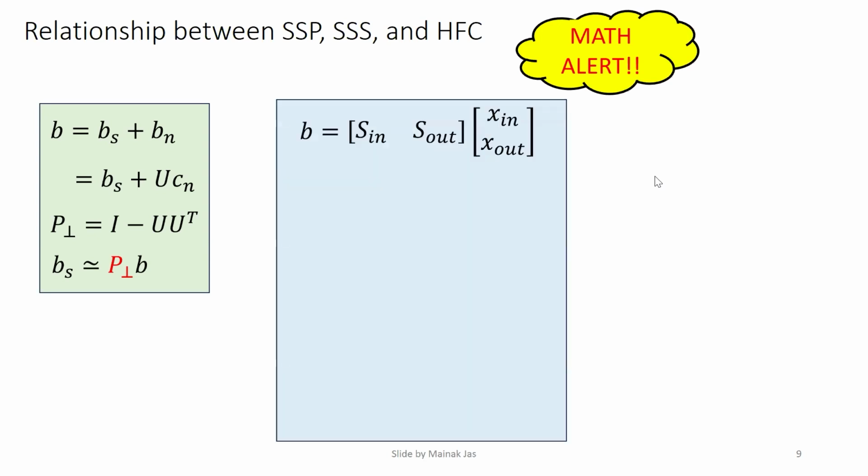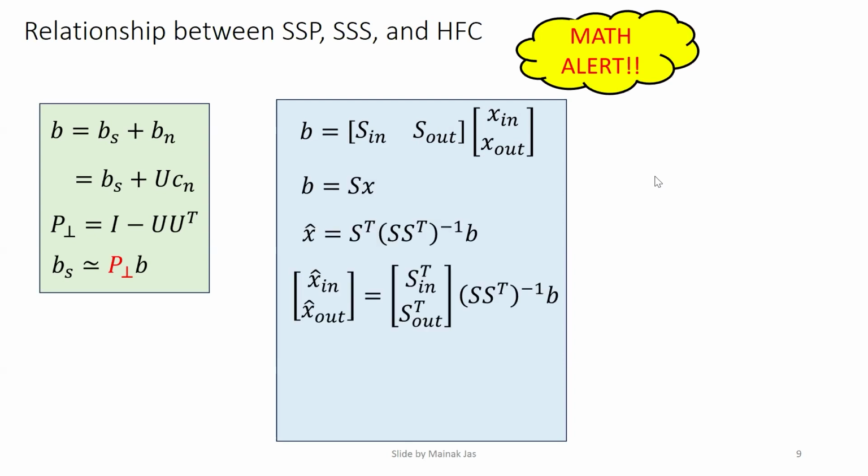When you do the signal space separation method, you try to separate it out in terms of inner and outer basis functions. There, you estimate the coefficients of these basis functions, and then you zero out the coefficients of the outer basis, and that gives you the final field, the signal of interest.